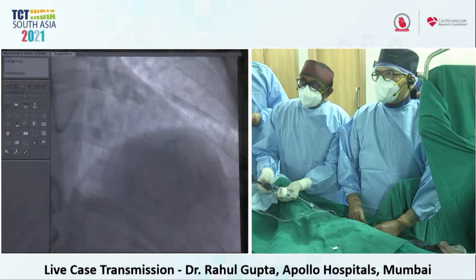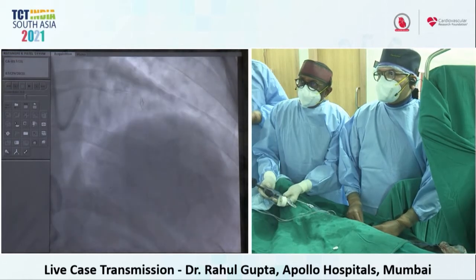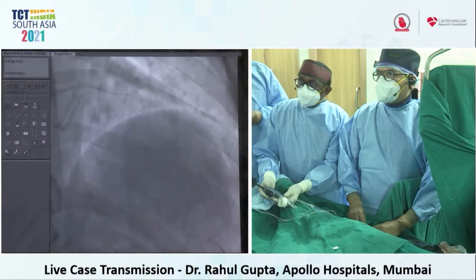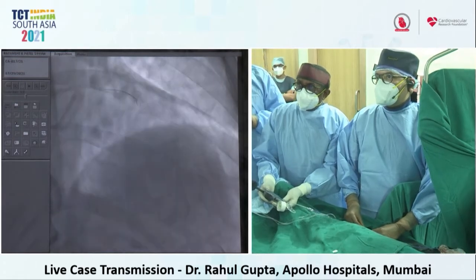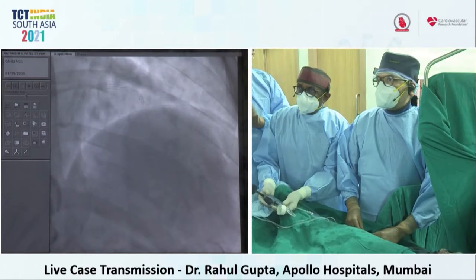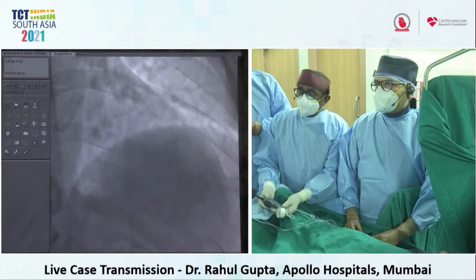Dr. Sanjay, are you using the same amount of heparin, or are you upscaling the heparin dosage when you are using these sheathless systems? Same. It's the same dose. I mean, you would use the same dose as you would do for angioplasty.